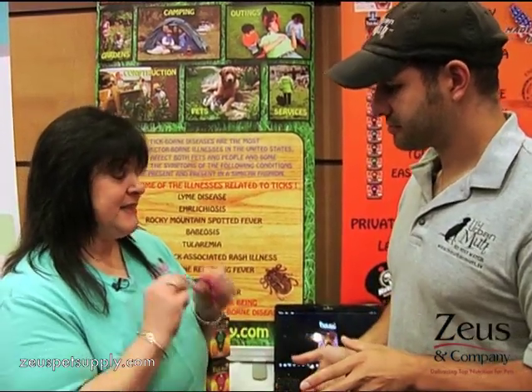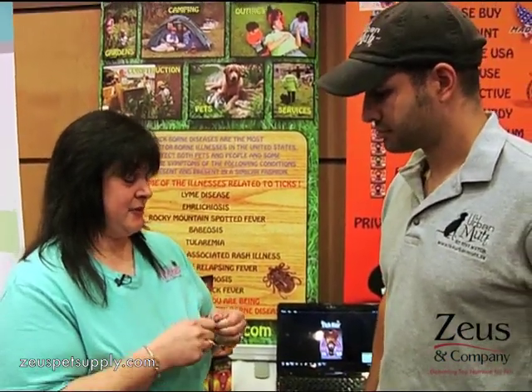Hi Donna, nice to meet you. Nice to meet you. So tell me about this little thing you got here. TickKey. TickKey is absolutely the easiest to use tick removal device on earth.